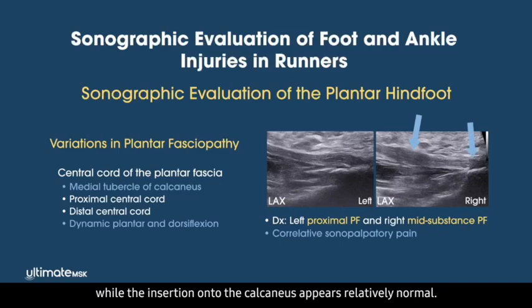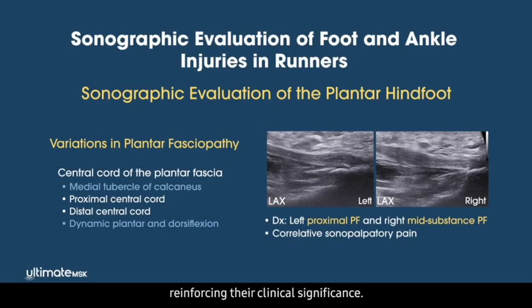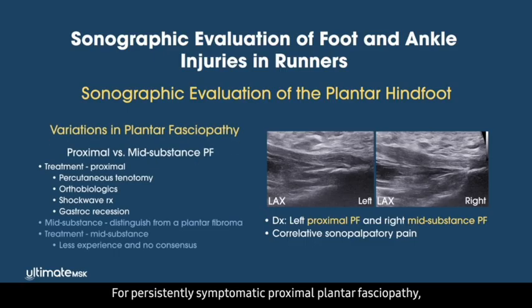onto the calcaneus appears relatively normal. The patient had corresponding sonopalpatory pain at each of these locations, reinforcing their clinical significance. For persistently symptomatic proximal plantar fasciopathy, a variety of treatment options have shown success. I typically begin with an ultrasonic percutaneous tenotomy.